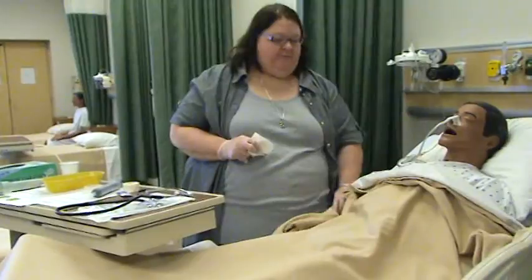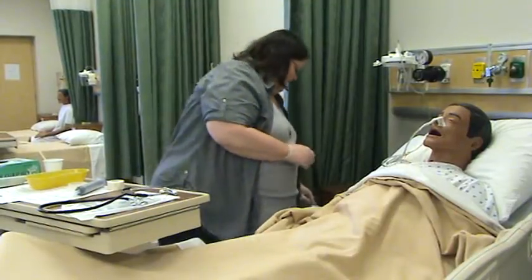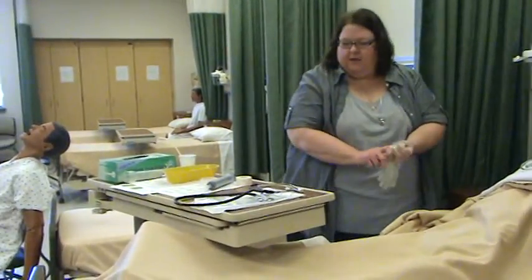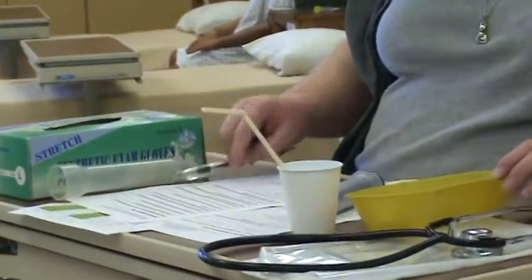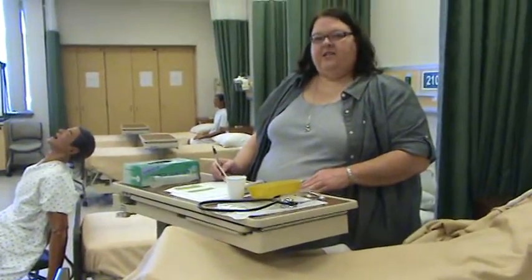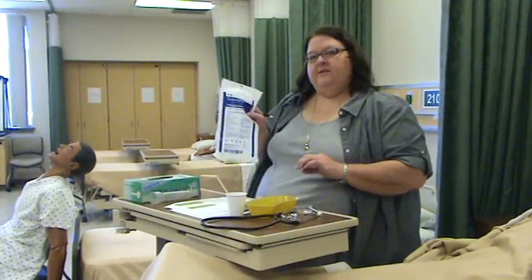You're all set, Mr. Pooh. I need to chart. Let me take these gloves off as I gather up my trash. So this would be in the flow sheet — I'd go to the electronic medical record under NG tube and put that I placed a 16 French saline sump in the right nare on 8-5 at 1:10, that I checked it with air, and that I checked it with return. And we are done.